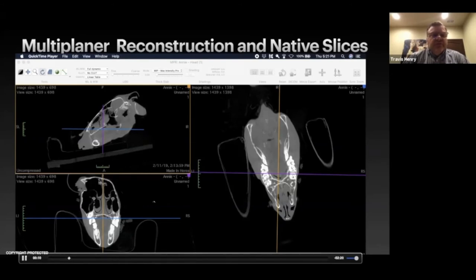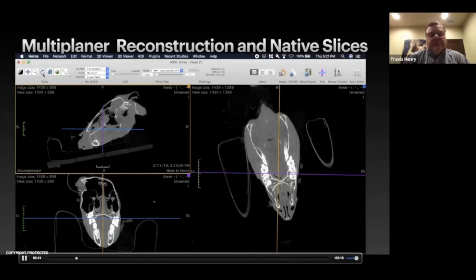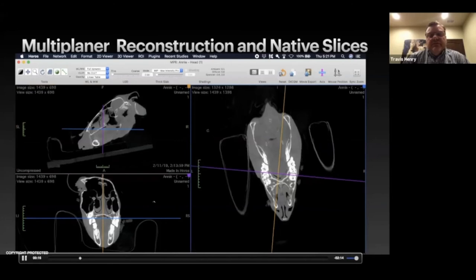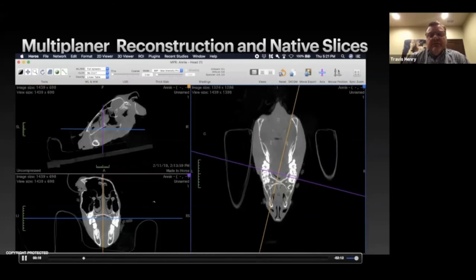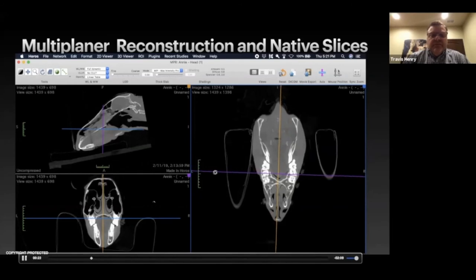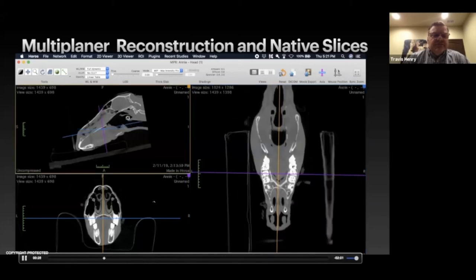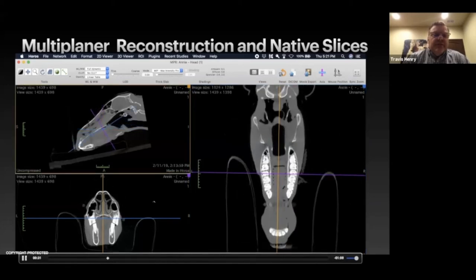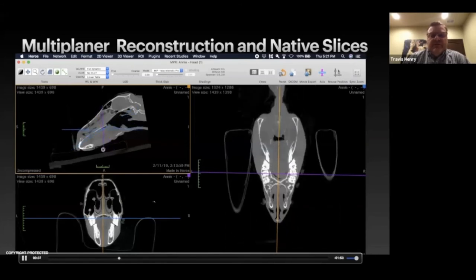You can see as the mouse moves — I'm grabbing the rotation device and spinning the horse to get it lined up. As I move the axis over the dorsal, the transverse and sagittal planes start to straighten out. Then I flatten the dorsal line on the MPR, and now you can see all of the teeth together. If I turn it back, you can see how we lose that alignment.